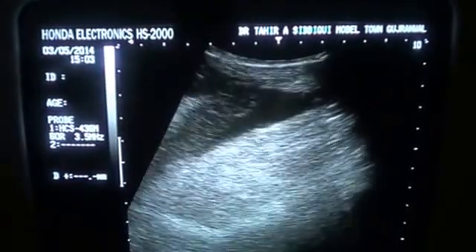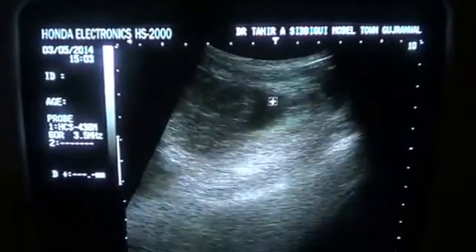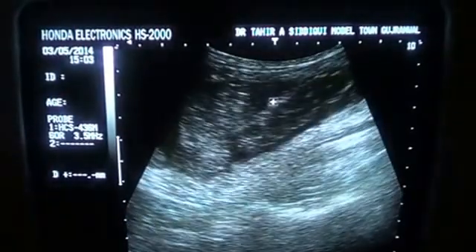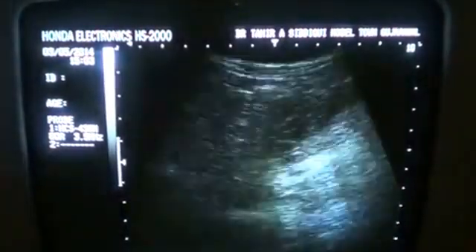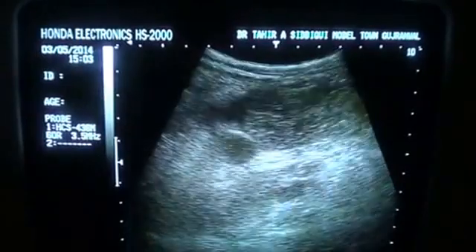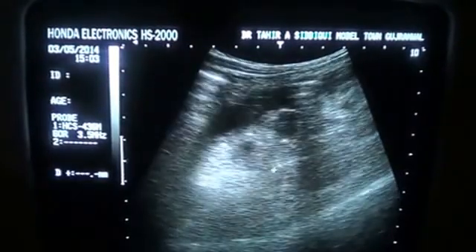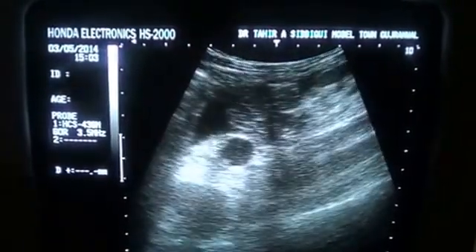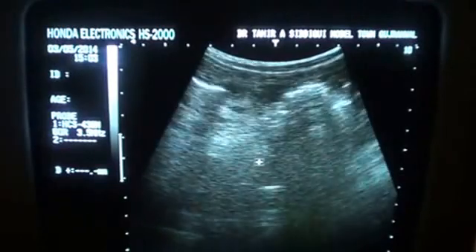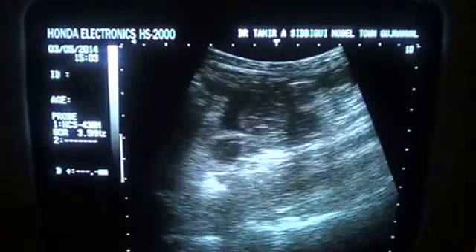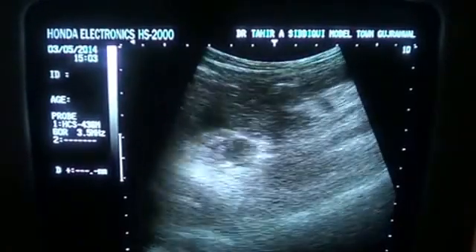These are the bowel segments, and why in the paracolic gutter? Because here you see the muscle — the iliopsoas muscle — and it is anterior to it. The bowel loops are floating in the fluid. Again, now see: this is the fluid again in the right paracolic gutter. This is the fluid in the right paracolic gutter. These are bowel segments floating in it.